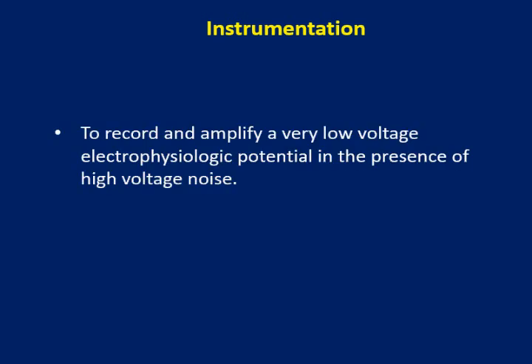Nevertheless, all of them have one common objective: to record and amplify a very low voltage electrophysiologic potential in the presence of high voltage noise. The recording conditions can be quite extreme, where the noise voltage may be 100 or even 1,000 times bigger than the neurophysiologic signal voltage.